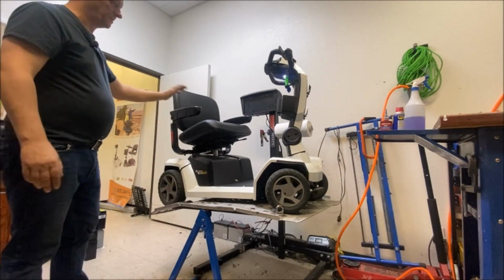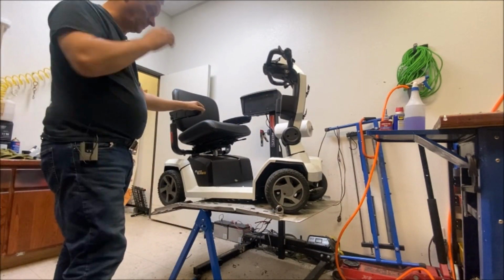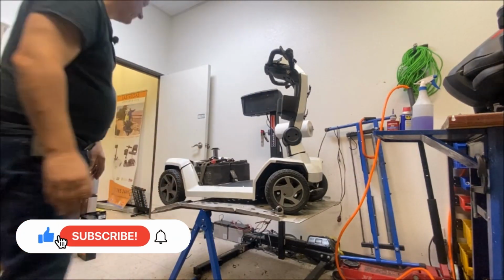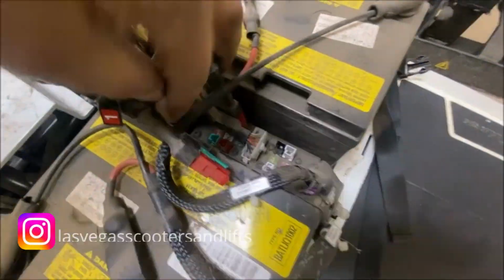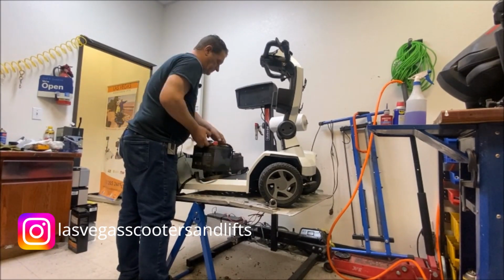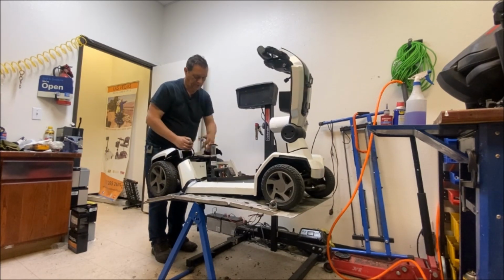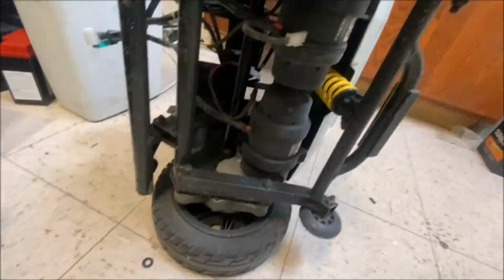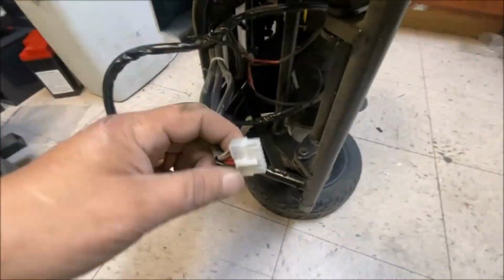Okay, when it comes to servicing scooters, what I tend to do is work methodically through it, take off as many parts as I can. You know, the simple things like shroud, covers, like the battery covers, take out the batteries. And the seat, of course, any accessories that customers might have on there. I left the mirror on there because it was a very minor thing. It's not going to be a problem when it comes to servicing. And then just check over everything. Do a double check of everything, to be honest.